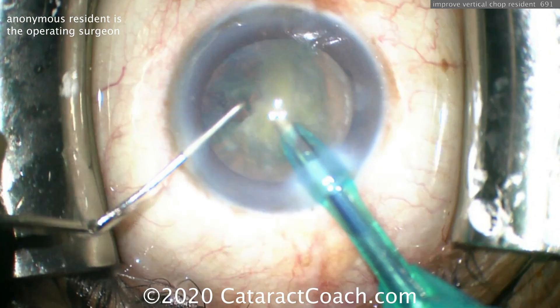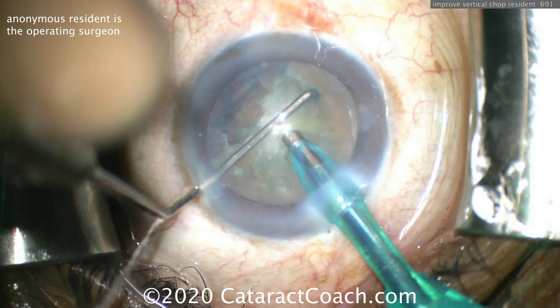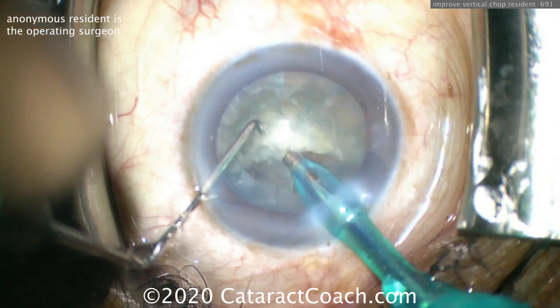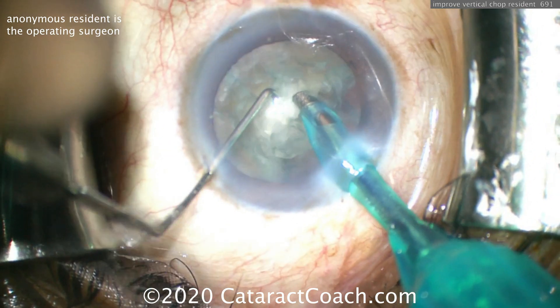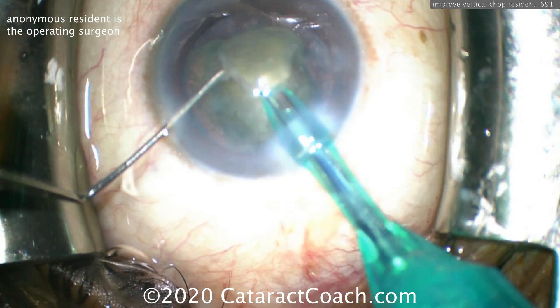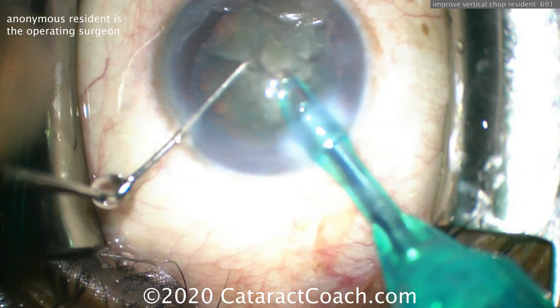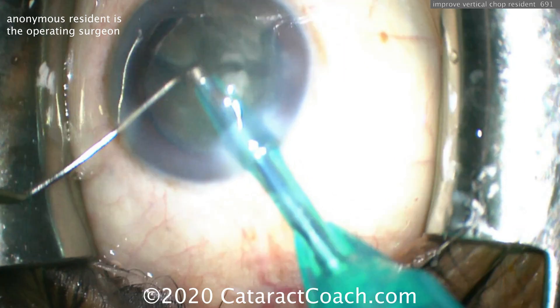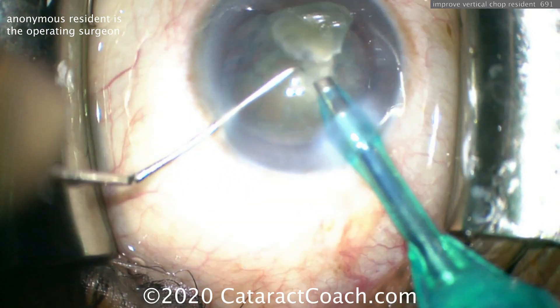Watch again — this piece of nuclear material goes down and watch the pupil margin. When it goes down after the occlusion is over, you get a little surge there. So the settings here need to be optimized a little bit better. Good technique, very talented young doctor, but we need to increase the inflow fluid or decrease the outflow or both. Again, watch this buzzing in with the probe — very nice chop technique, but look what happens when we take this nuclear chip down. You'll see a little bounce or surge in the anterior chamber, and that tells me that for a fraction of a second we're aspirating more fluid than is being replaced in the eye. The solution is to decrease the outflow fluid and or increase the inflow fluid.